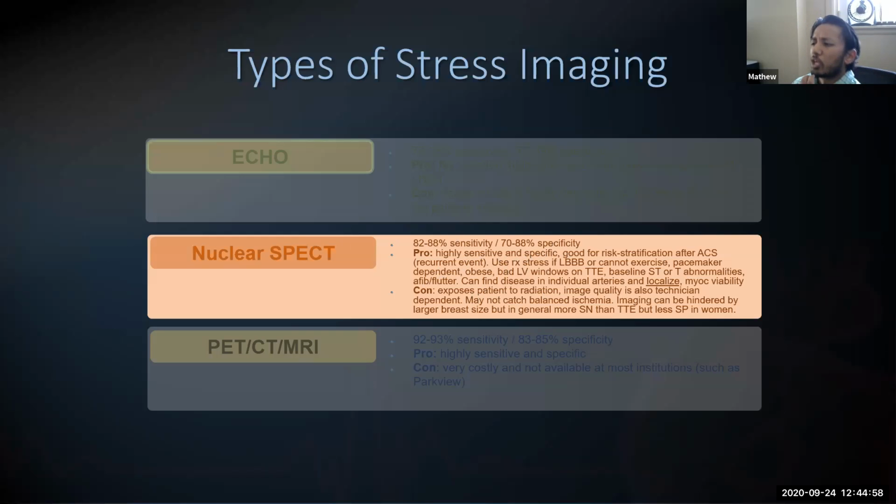Sometimes these patients are given a card that they can use if they're going to go on a flight soon, because they are going to show up as being radioactive. So especially if they're doing international travel with the state of global affairs right now, they're going to have that card when they go through TSA.